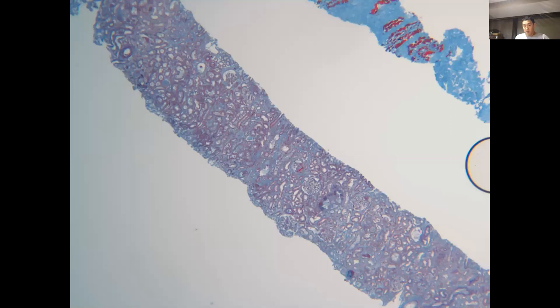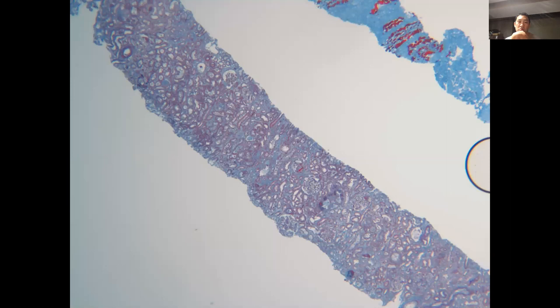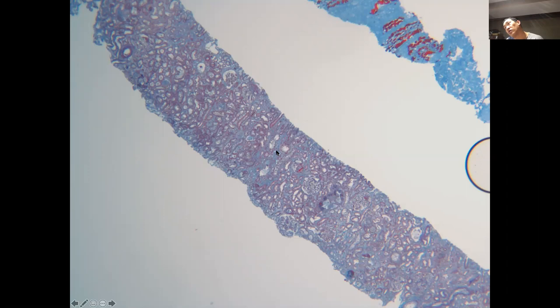Amyloid is high on the differential because this presents as nephrotic syndrome — that's classic for amyloid. Cast nephropathy more likely shows acute rise in creatinine, which is almost never normal in cast nephropathy. The low albumin makes amyloid or monoclonal deposition disease more likely comparatively. Let's go to the images. This is a trichrome stain — there's some blue, but it's patchy.